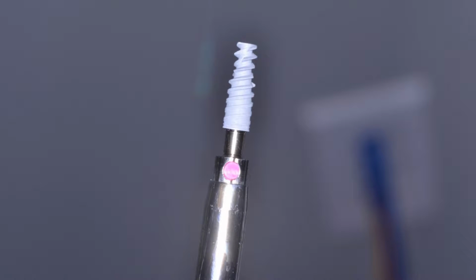And as we talked about in the previous features aspect, you can go from the buccal aspect and move the implant towards a more labial screw retained position in maxillary applications. That's one of the cool things with this implant. In terms of other reported features, what's new, what's missing.